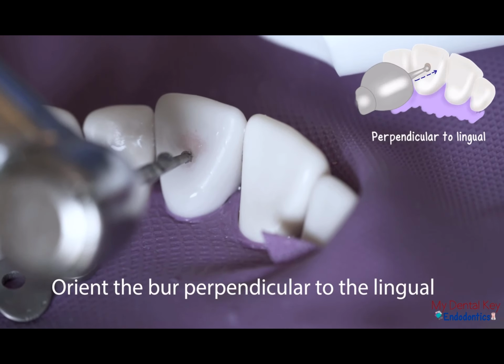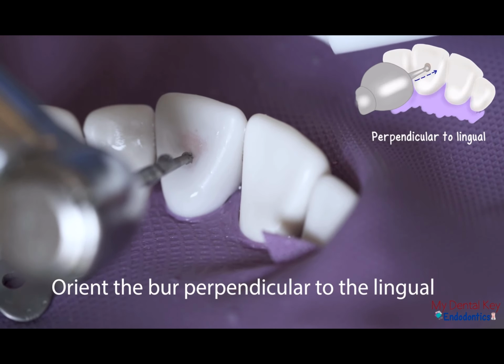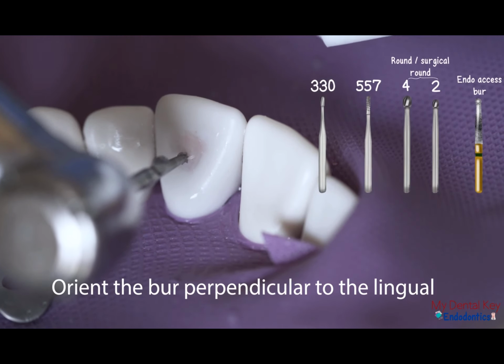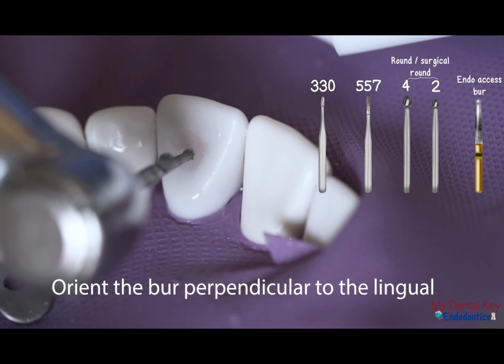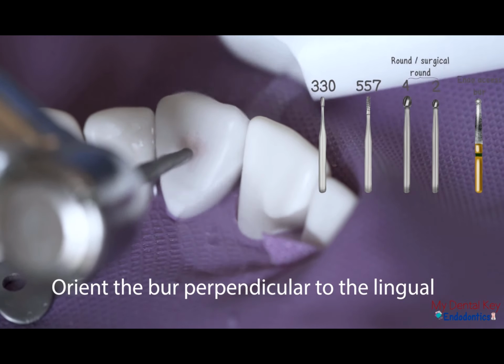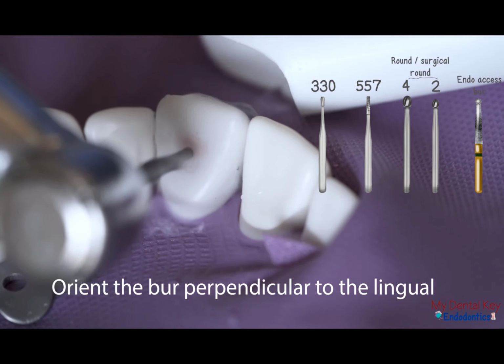Using a high-speed handpiece, orient the burr perpendicular to the lingual surface. Burr options include carbide burrs, numbers 330 and 557, number 2 and number 4 round burrs, and the endo access burr. For the CDCa, we recommend using the number 2 round surgical burr. Penetrate the tooth to a depth of 2 to 3 mm to enter the pulp chamber.